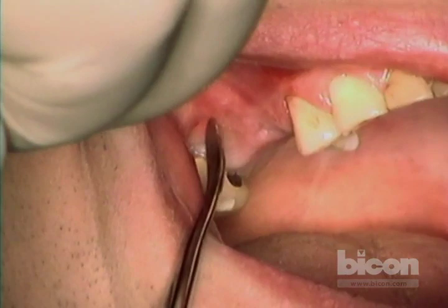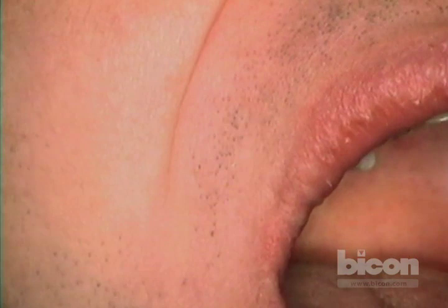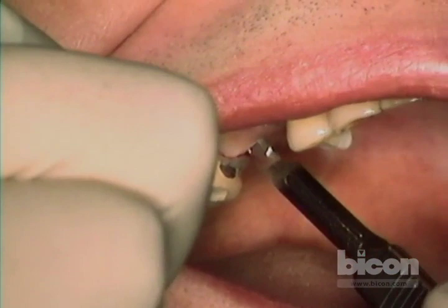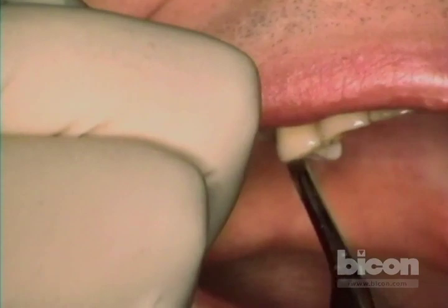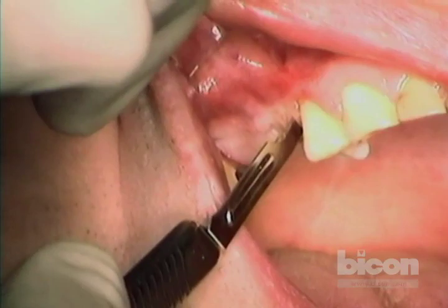The intent is to expose the crest going from the palatal slope all the way to the full buccal slope. I will use a papilla-sparing technique, however in the distal I may not, only because the space is so tight. I favor as continuous an incision as possible.